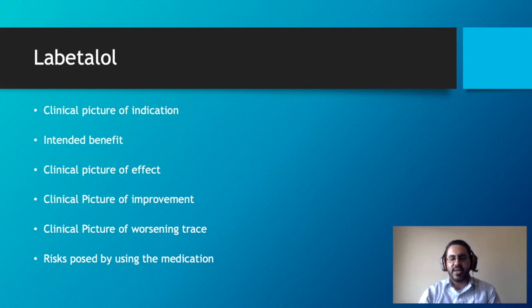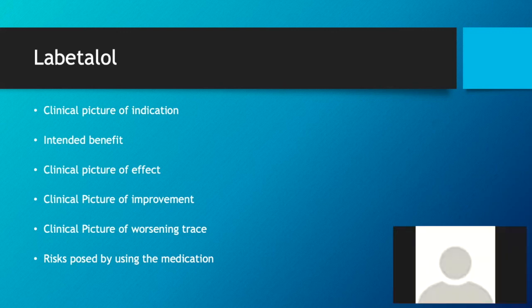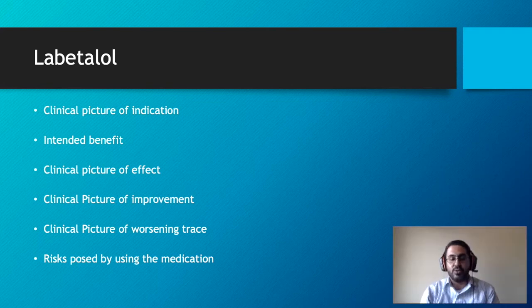Let's imagine what effect that can have on the baby's CTG or on the baby's heart rate in general. What's going to happen to the baseline? Go down. So it's going to drop a bit because we have less sympathetic or almost no sympathetic. What about variability?